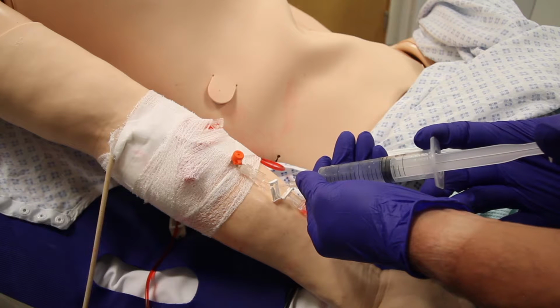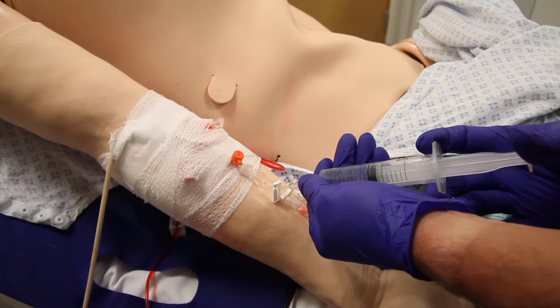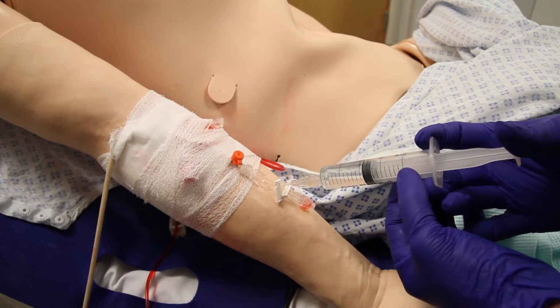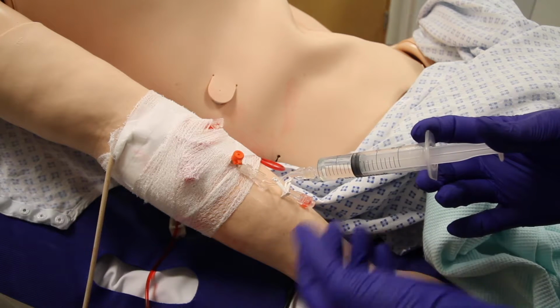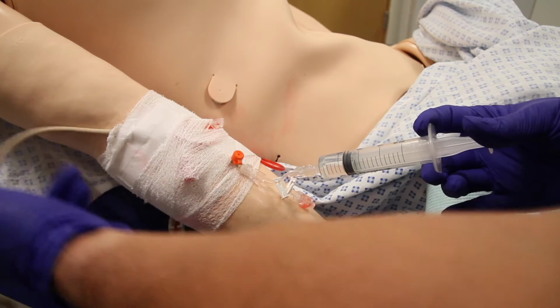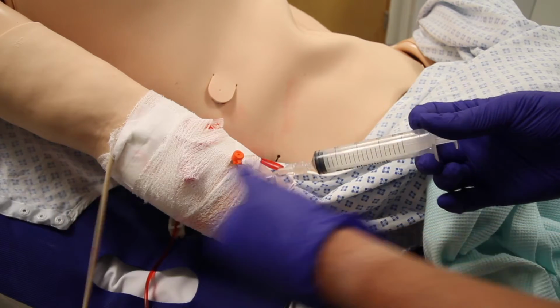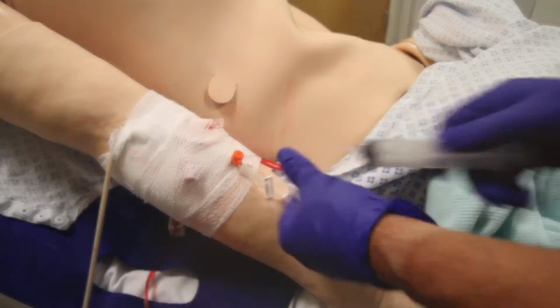And so you can tell him, Brian, I'm just going to give you a small injection here, just to make you feel better. It's just some antibiotics. So you can see that the cannula's flushing through nicely there, and that's just going away into a collection bag, which you might just be able to see in shot here. This is not anything to do with your scenario. This is just a way of us collecting the fluid that we're putting in. So that's the cannula.